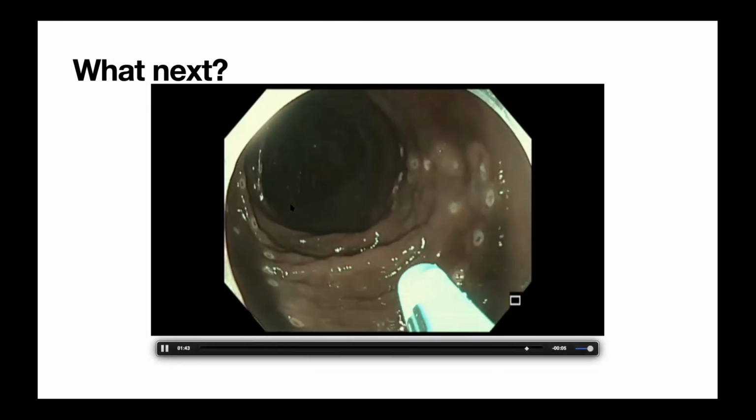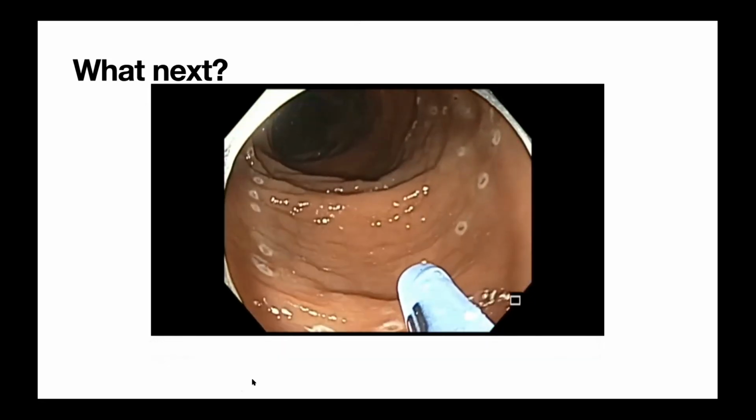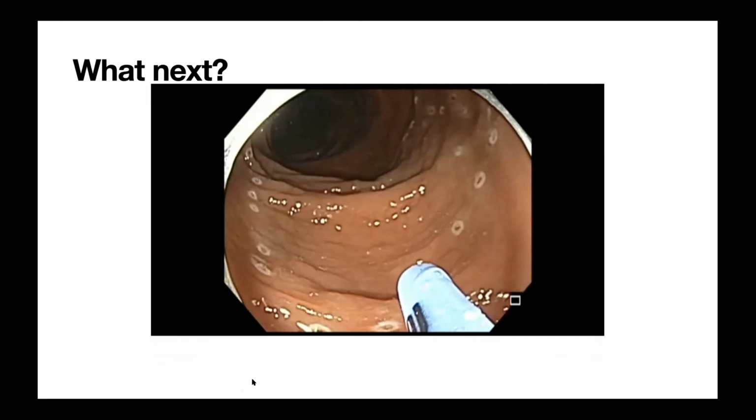It's a big SSA. Yes, a big lesion, yes. So one thing is the difference between Roy and Sylvia: Roy committed, Sylvia did not commit yet. It's 100%.